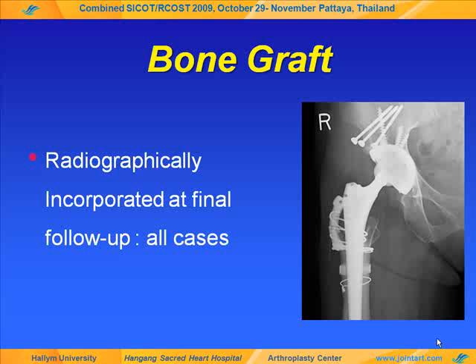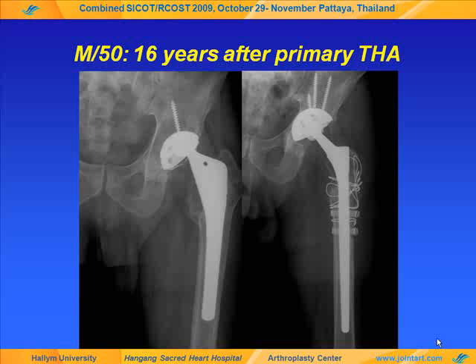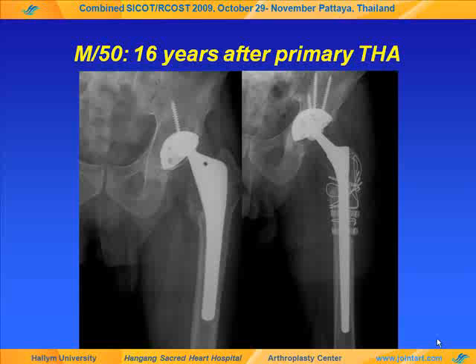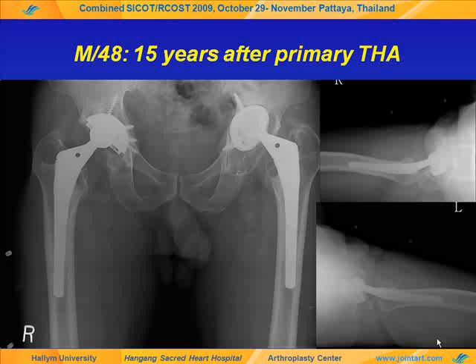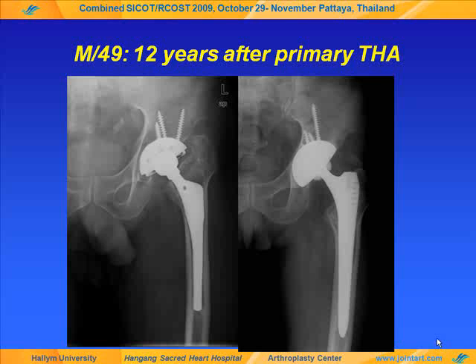I'm showing several cases. A 50-year-old male patient with extensive osteolysis and liner dissociation was revised after 16 years of primary total arthroplasty. A 48-year-old male patient with bilateral total arthroplasty operated 15 years ago presented with extensive osteolysis and loosening of the cup. Both hips were revised successfully with ceramic on ceramic bearing and bone graft. A 49-year-old male patient was revised for loosening of femoral stem.